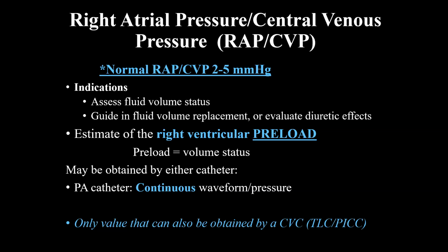Here's the thing. If the patient has changed positions in the meantime, shouldn't I level and zero again? Always, always, always. Don't go, oh, their CVP is now 50 when they've moved in the bed and it's not accurate. So when you start seeing numbers that don't match up to what they've been running, go back to the beginning, re-level, re-zero, calibrate, do the square wave test, do all of that to ensure the accuracy of your numbers. No physician likes to be called at 4 a.m. with a stupid number that's not accurate. They'll be really, really mad at you.